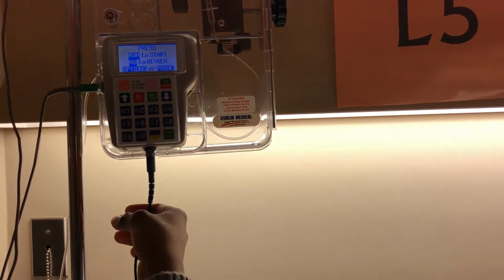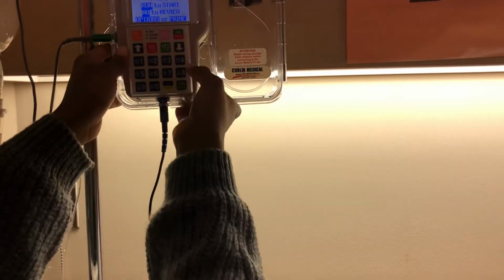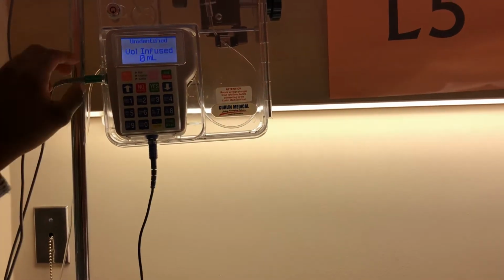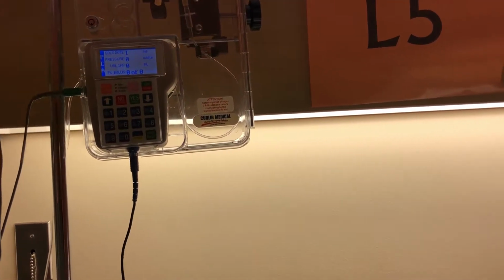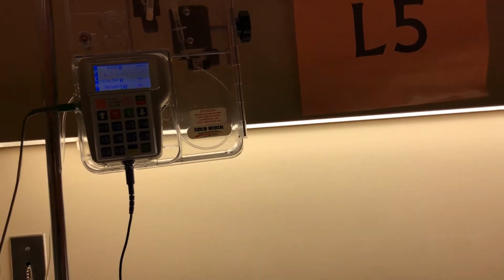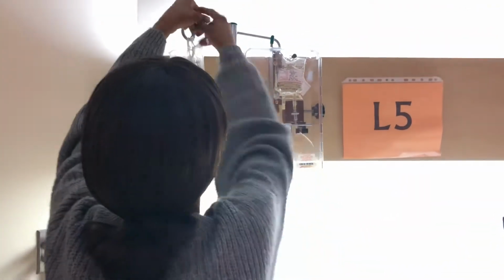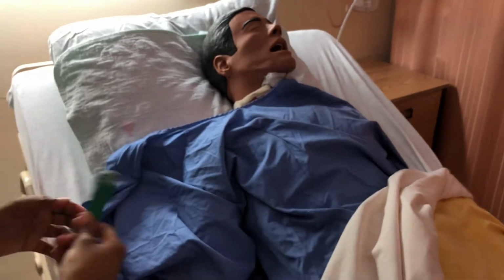So now I have done everything, primed, and it's already connected, so I'll press run. While I press run, I'm going to watch out for the beeps. So it's beeping, that means it's actually flowing. And then also I would educate the patient about this. I'm gonna let them know that they are the only ones that can press it, and they will hear a beep. Not even the nurse can press it.